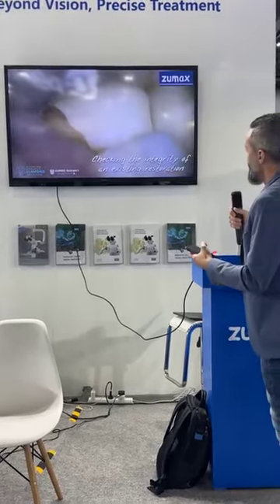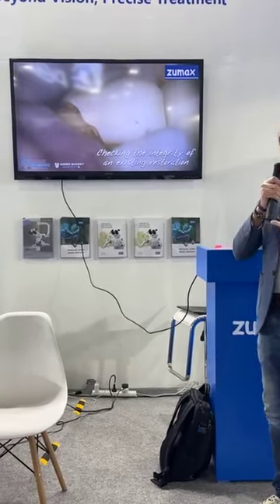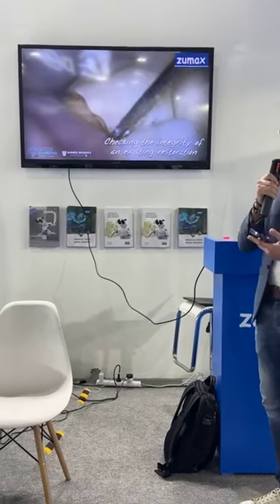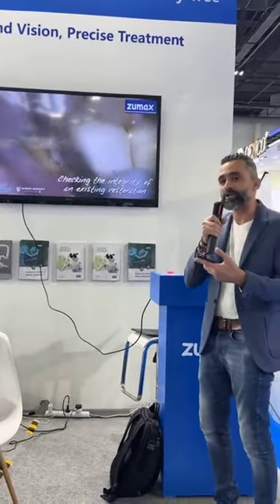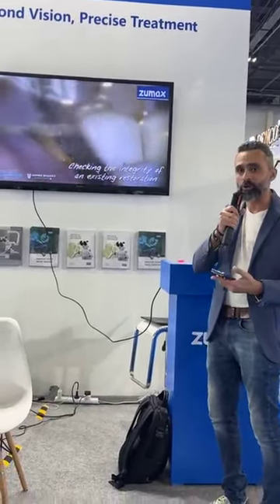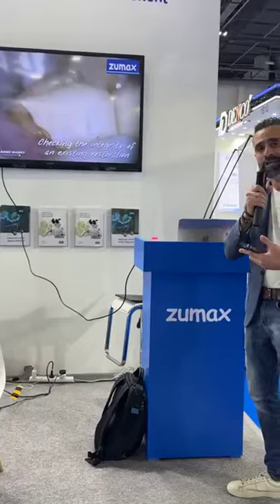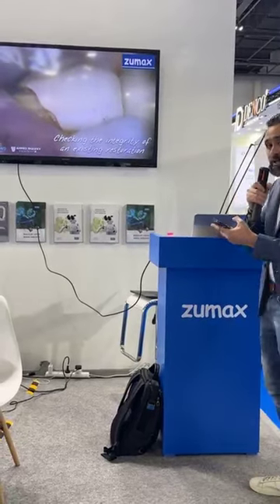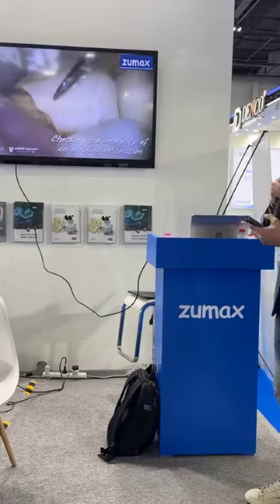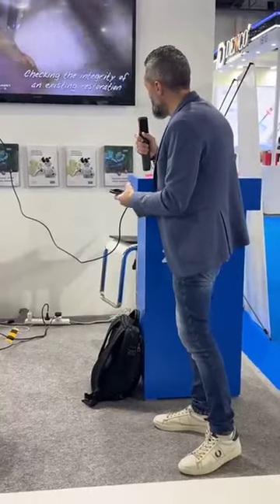In these cases, I will show you here that we can check the integrity of the coronal restoration with the microscope, because sometimes we need to decide whether we need to remove the crown and do our root canal treatment, or we have a good crown and good margin, so that we can go directly to micro-apical surgery, for example. So it's important to examine the periodontal condition as well as the marginal adaptation of the restoration.